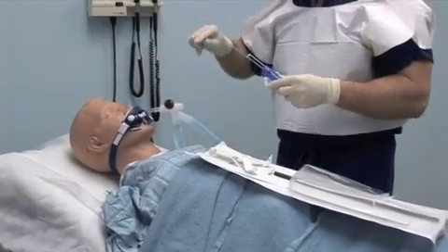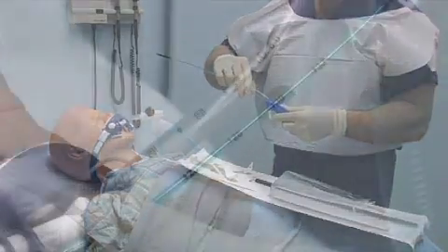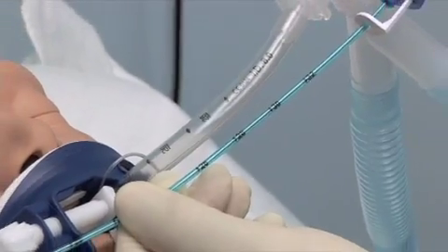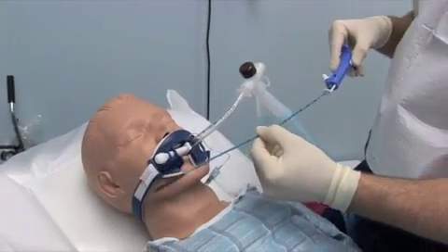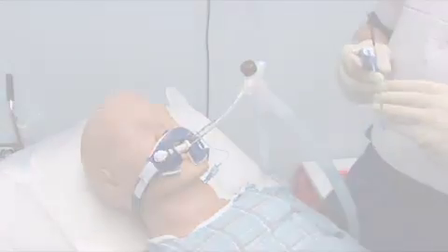If the ventilator tubing was disconnected from the endotracheal tube for the calibration procedure, then reconnect it to the endotracheal tube. Take care to not move the depth calibrator tab or depth calibrator disc from this calibrated position during suctioning or cleaning of the endotracheal tube.